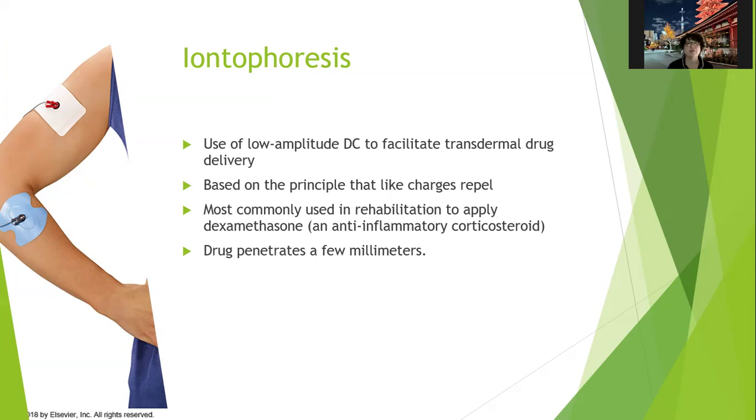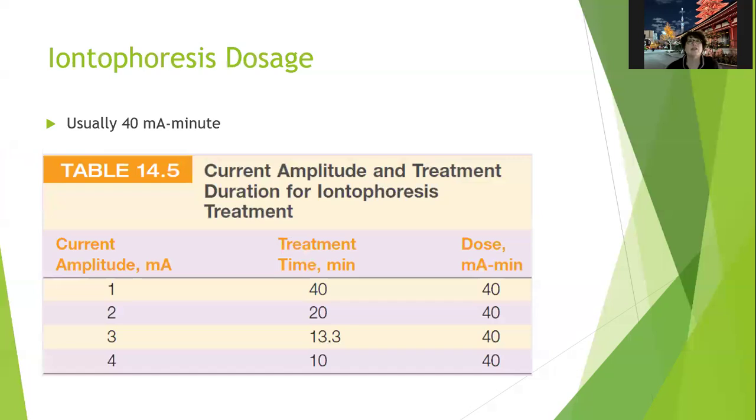Usually the medication is prescribed by the doctor, and either the patient goes and picks it up and brings it in with them, or if you work in an inpatient facility or hospital system, it's usually delivered through the pharmacy department of that system, and then you apply it in physical therapy.